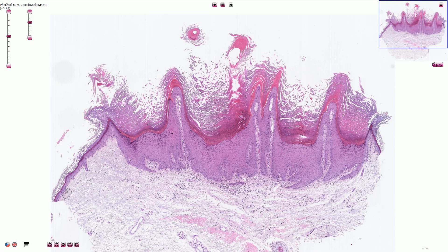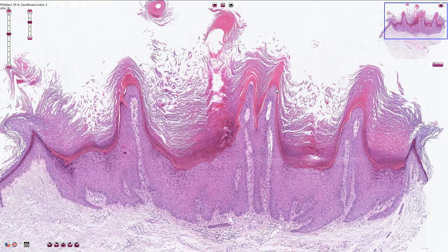Under the microscope we typically see papillomatous exophytic proliferation. The epidermis is typically much thicker, acanthotic, and on the surface we can find hyperkeratosis and parakeratosis.